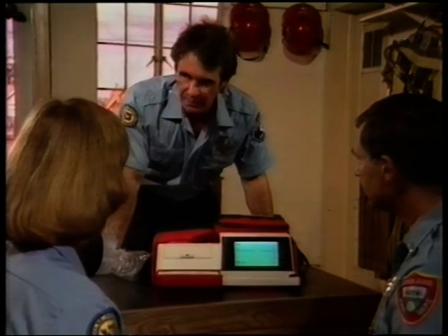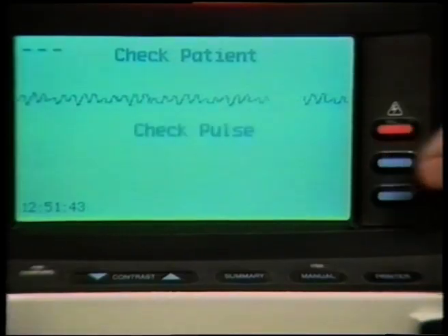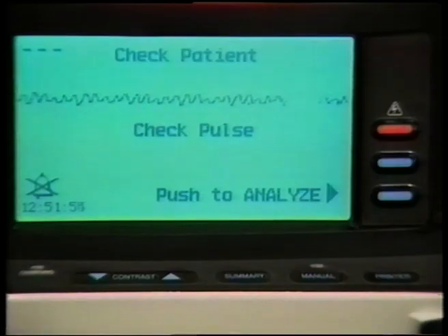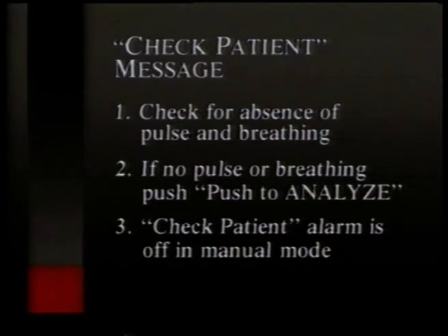If silencing the audible prompt is desired, push the Silence display button. The Check Patient audio tones are silenced for 1 minute, and a symbol appears in the lower left corner of the display to remind you that the device is in a silenced condition. No other audio prompts are silenced during this minute, only the Check Patient alarm. The Check Patient alarm cannot be permanently silenced. Remember that when in the manual mode, there are no Check Patient alarm capabilities.